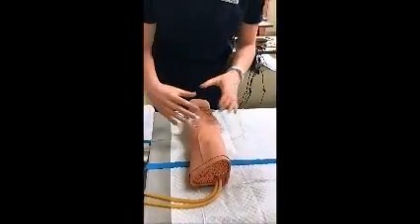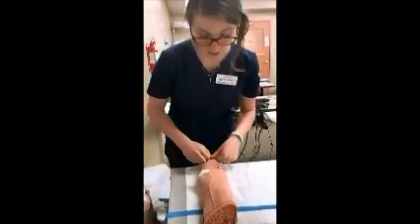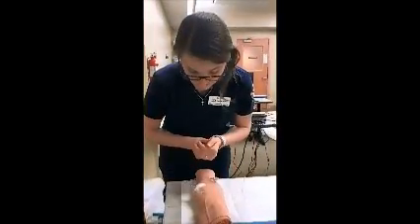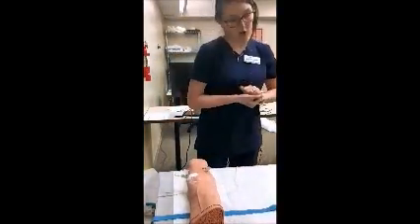If it's infiltrated, it'll be kind of pale, raised, cool to the touch. And then any evidence of bleeding. We don't see any of those. His IV site looks fantastic. So we're going to ask Joe.